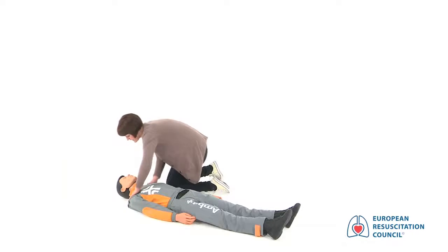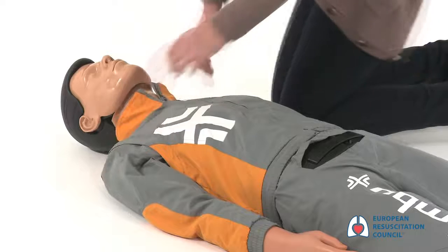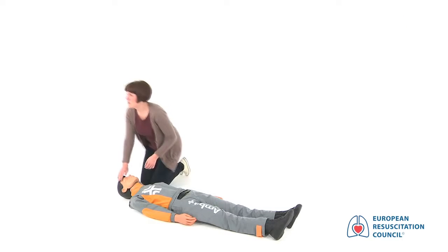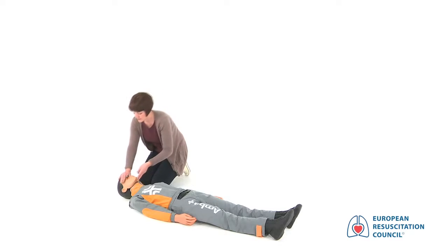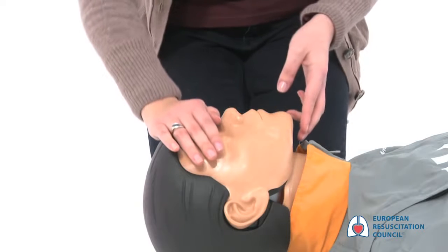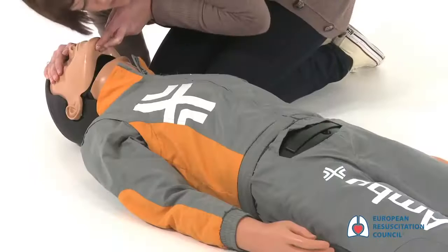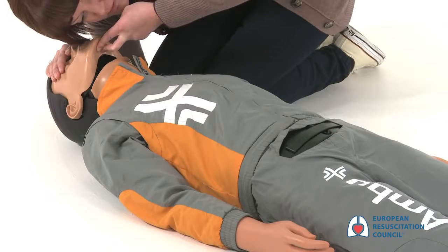Gently shake the victim's shoulders and ask, "Are you all right?" If the victim does not respond, shout for help. Open the airway by gently tilting the head and lifting the chin with 2 fingers. While holding the airway open, listen, look, and feel for breathing for up to 10 seconds.